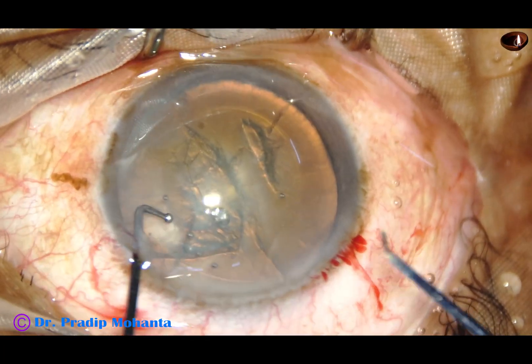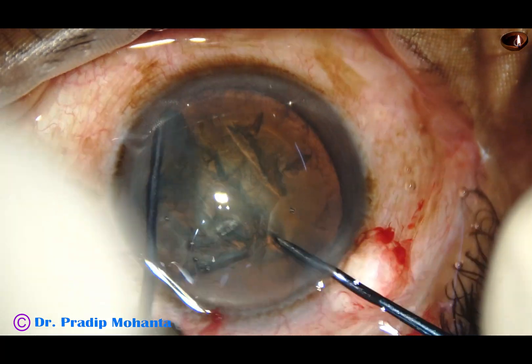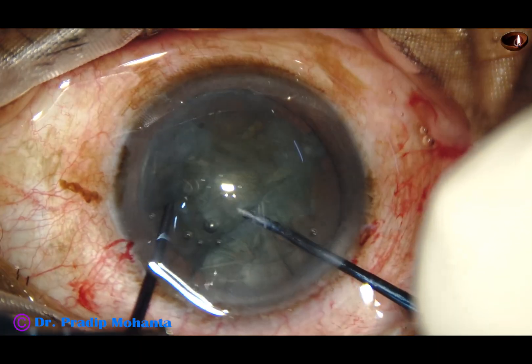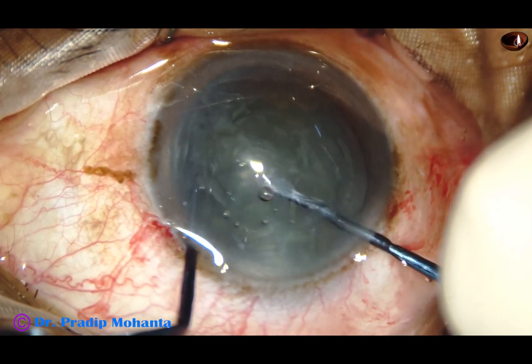Now, this is real time. The nuclear sustainer goes through the side port and hooks the equator. The pre-chopper goes through the main port. The two instruments come to each other and we divide the nucleus into pieces in just 45 seconds.